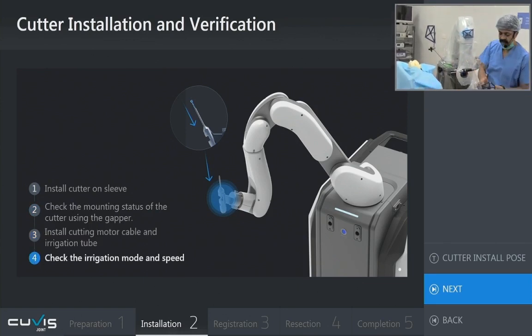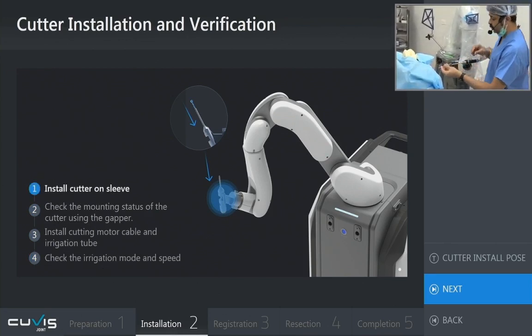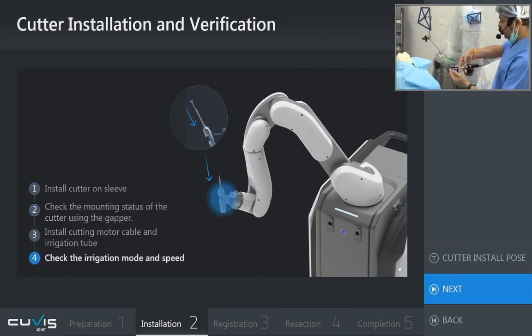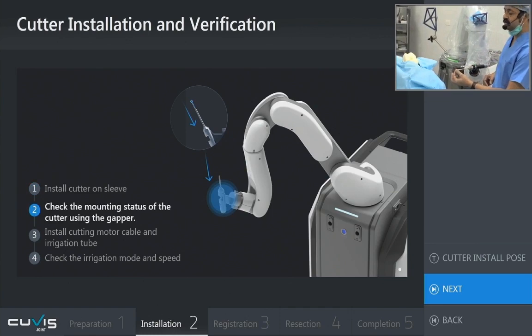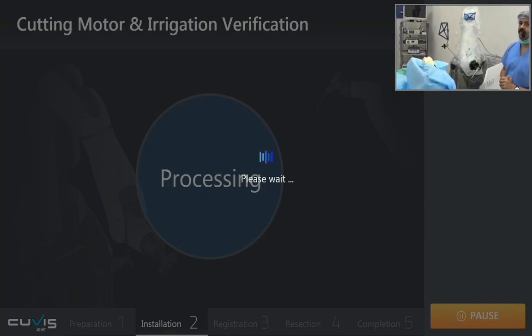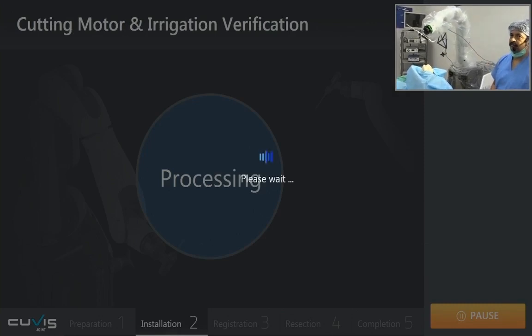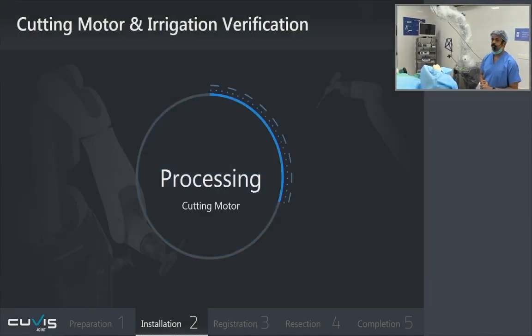the entire assembly is out, and then I can show you the tool which is pushed in here. So once the tool is in here, all you need to do is one half turn and the tool is fixed. You can see that the tool is completely fixed in place. And there we can go to the next step. Each time it is going to ask you the confirm window, where it will be telling you to confirm the thing, and hence it just processes.